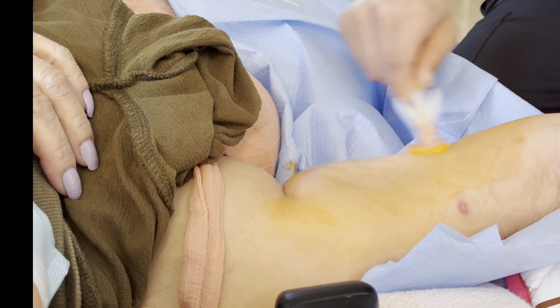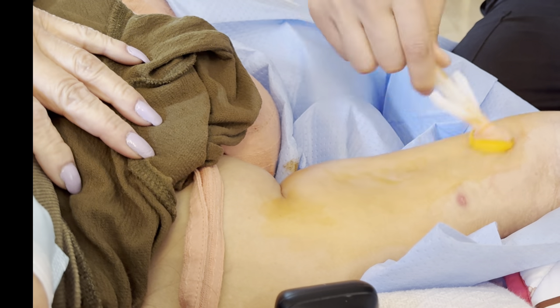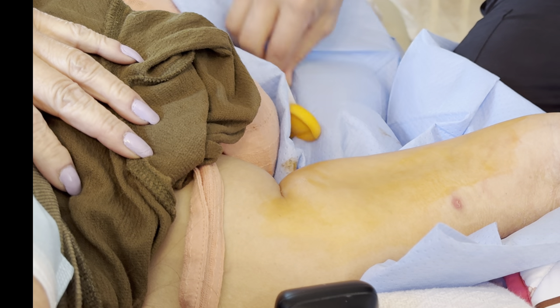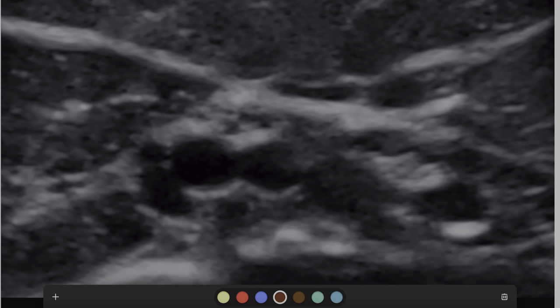How long have you been in this field? About seven years now. You seem to love it — oh yeah, I do. Like a scientist? Oh yeah, for sure. Let's just scrub for a full minute. Now, here's a recap of identifying structures. My philosophy is that you cannot truly know what a structure is unless the ultrasound image is in motion. You cannot identify by a circular structure or a hyperechoic or porous-looking structure alone — you may make good guesses, but you still need to put that ultrasound tissue in motion to identify what it is more accurately.